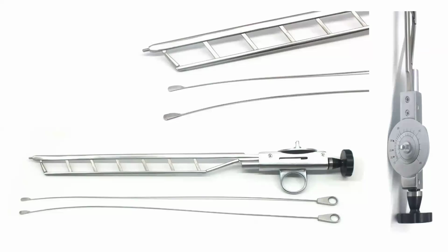See, first of all, it is not a fixed part, right? So when you are cutting, you may not be able to cut exactly in the midline. And on either side, there are blood vessels, arteries. So you may damage 11 and 1 o'clock. Number one. Number two, our purpose is what?